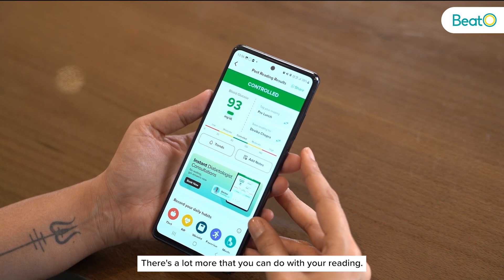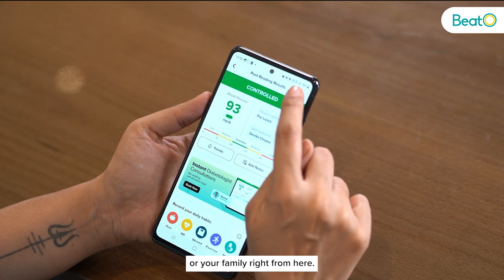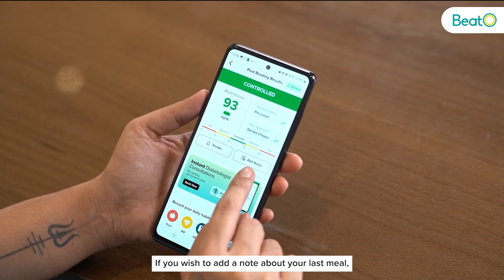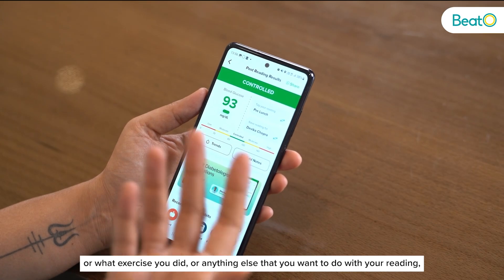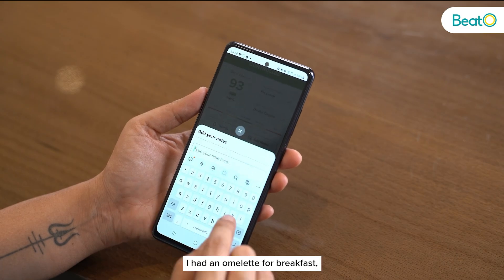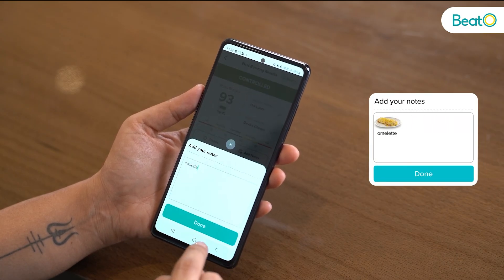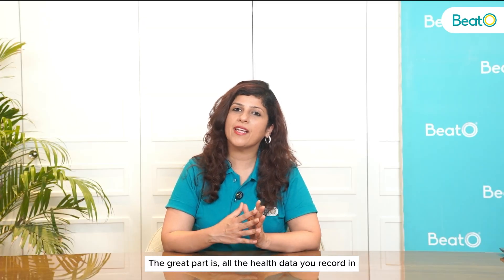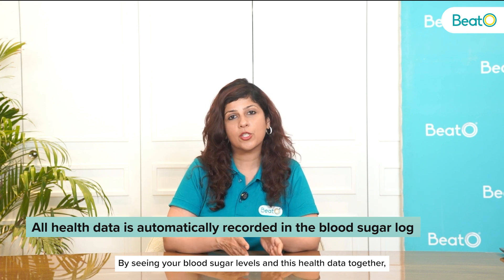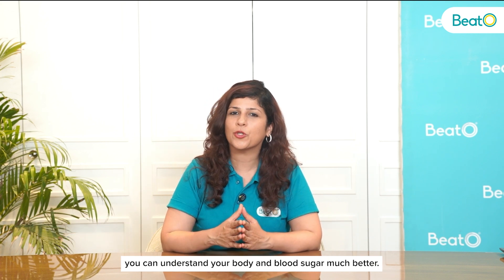There's a lot more that you can do with your reading in the Beto app. You can share your reading with your doctor or your family right from here. If you wish to add a note about your last meal, exercise, or anything else related to your reading, you can do so from here. All the health data you record in this section shows up with your blood sugar log, so you can understand your body and blood sugar much better.